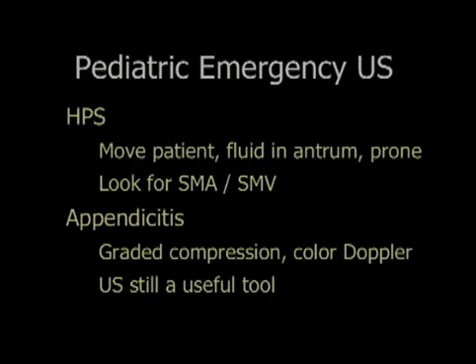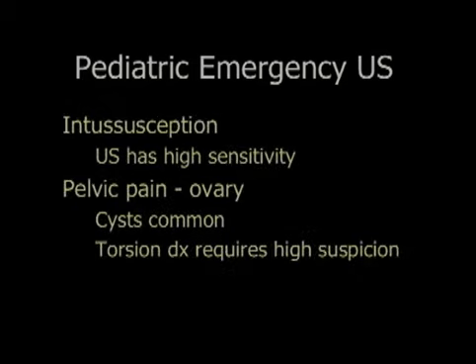Appendicitis is still the most common cause of emergent surgery in children. The graded compression technique and the use of color Dopplers as an adjunct generally will lead to success in the vast majority of cases. In spite of the current popularity of CT, ultrasound is still a useful tool and should still be considered the first line in imaging in any child with appendicitis. Intussusception, ultrasound has a very high sensitivity for finding intussusceptions. In pelvic pain, like in adults, ultrasound is the imaging modality of choice.